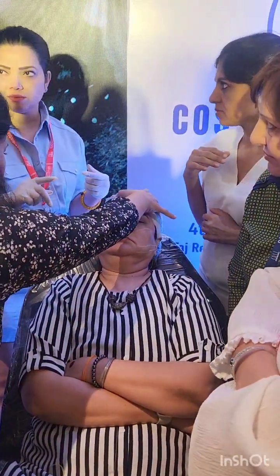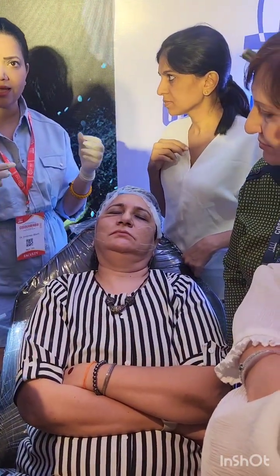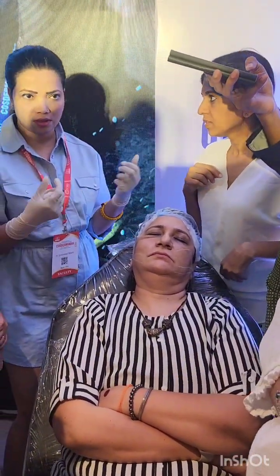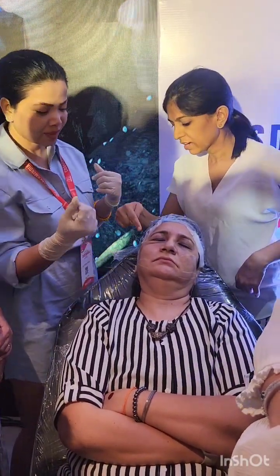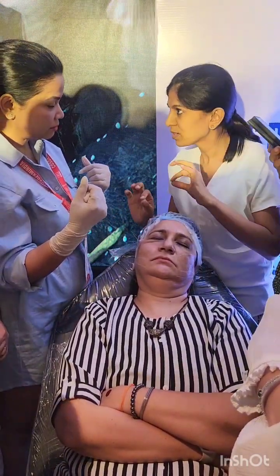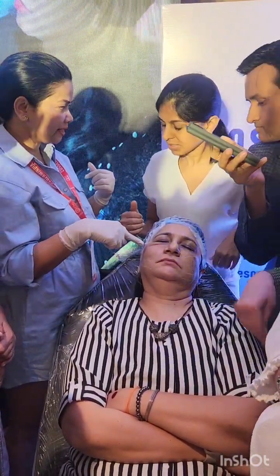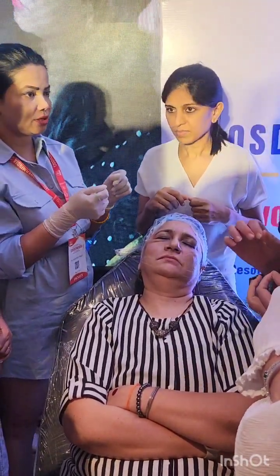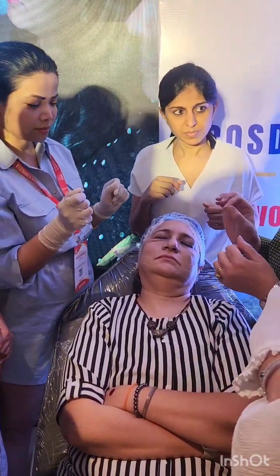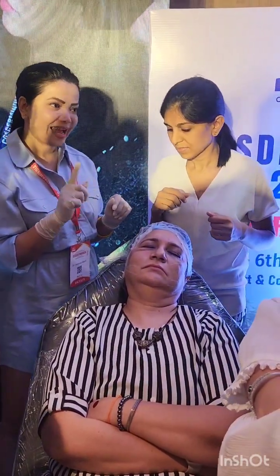So never cut the thread before you do both the sides, because sometimes asymmetry can occur because of the laxity in the skin and the kind of sagginess you have. No, because we have tied it. The rotation is for that only. Can you release somehow, to know how to release? Nice, clever question. I'll do that after I do this.